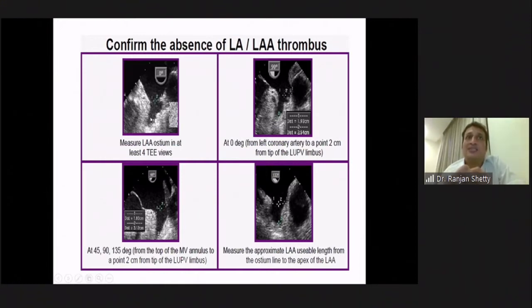So you look at the left atrial appendage. Now this appendage has to be profiled. So this is a two-person job. That means you need to have an echocardiographer or a sonologist or one more cardiologist who is completely aligned with you. That means you need to have a team of doctors. It's not a one-person thing. So when you measure appendage for WATCHMAN, that is what we are going to discuss, and Dr. Ramesh will take it from me later and add some extra points here. See, all appendages have two parts. One is the neck, second is the body.